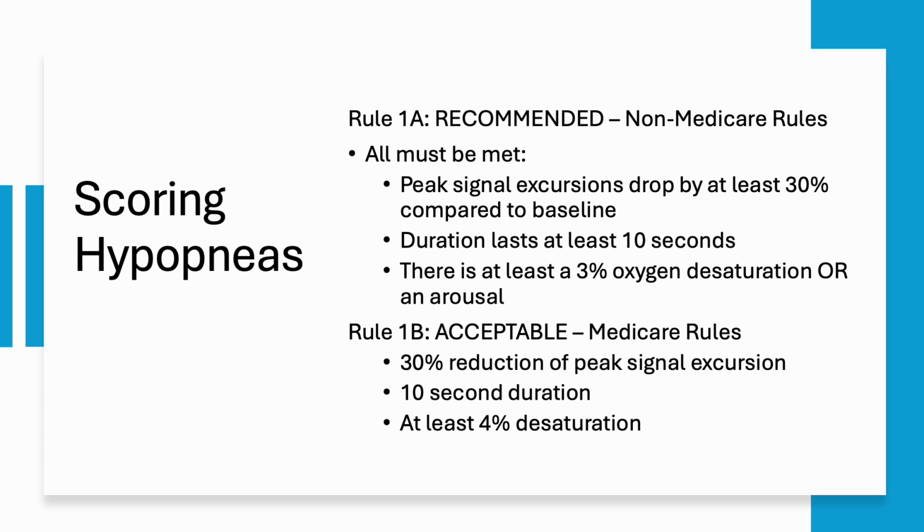So this makes the AHI underscored because it's harder to get a 4% desaturation than a smaller 3% desaturation or just an arousal. You can still call these RERAs, which we'll talk about later, and that will be reflected in the RDI, or the Respiratory Disturbance Index.